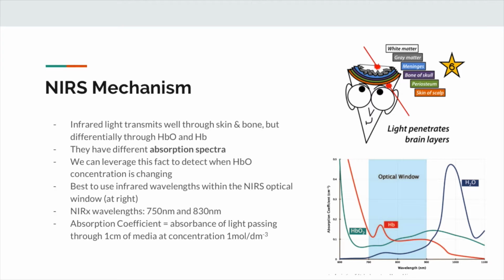The way you can read this graph is on the left you have the absorption coefficient, which is essentially how much of this energy is being absorbed as the light passes through a medium of this type. And then along the bottom is the wavelength in nanometers. Near infrared around 700 nanometers is pretty visible to our eyes. That still looks red to us. 900 is getting larger. We can't see that anymore. But you'll see in areas like 750 or 850, the plots for oxygenated and deoxygenated hemoglobin are different. And so that's what we choose as wavelengths to care about when we're doing infrared spectroscopy.